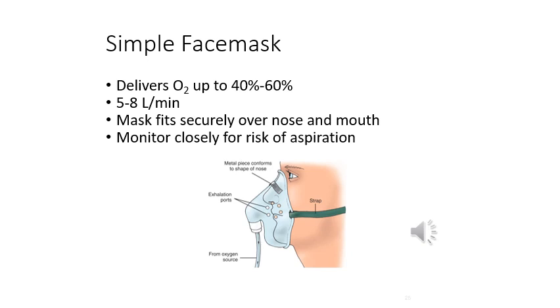You also want to be monitoring your patient who's on a simple face mask for risk for aspiration. And then also just be mindful that patients can become claustrophobic with that mask on. And then you want a secondary oxygen delivery system for when the patient eats.